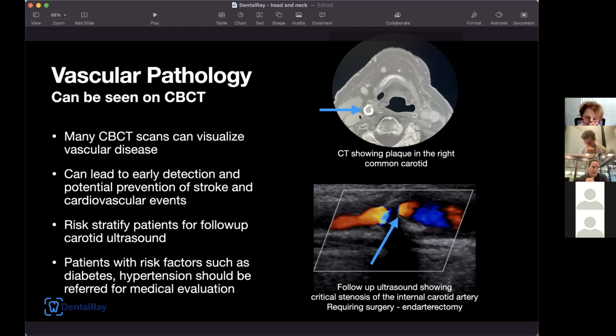And I think Garry referenced his interest, with their organization, in pursuing research and validating evidence-based radiology interpretation and care. Since we have such a high number of patients that are getting cone beam CT, and we're most of the time evaluating the carotid arteries for calcification, I'd be really interested to see if we could start to provide a body of evidence that would allow us to score the calcification and risk stratify patients.